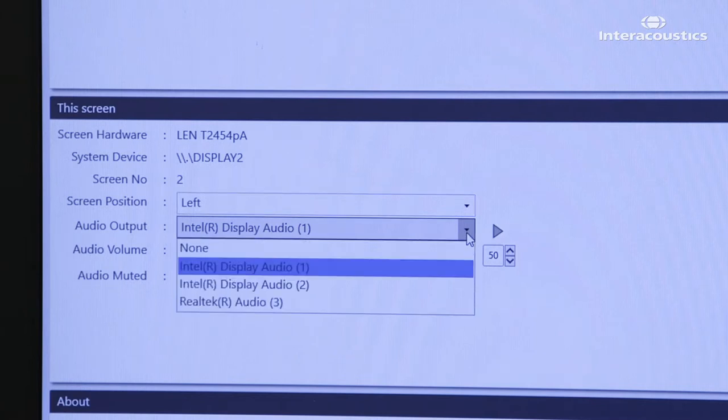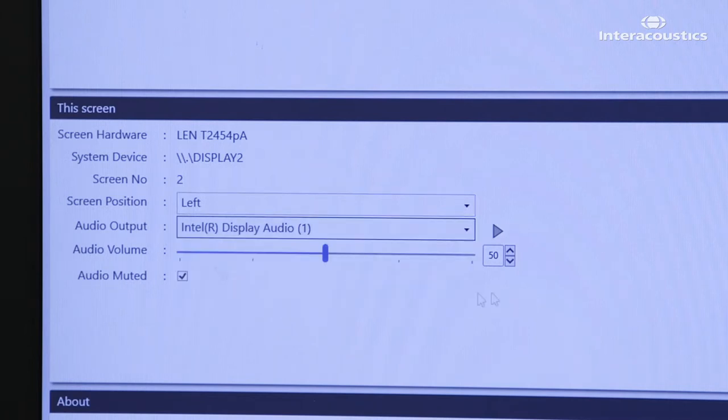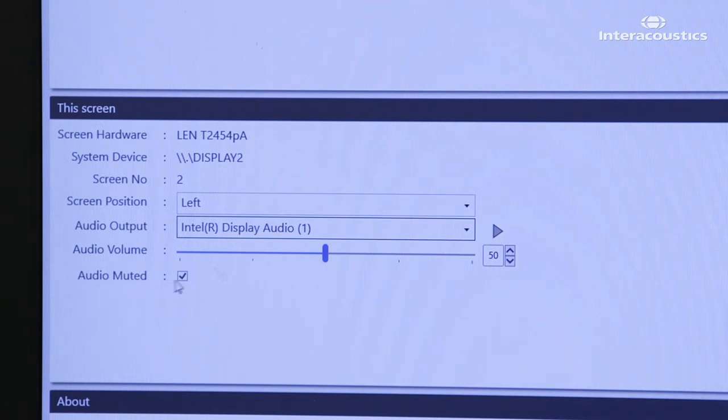You can also choose what speaker you have connected and you can choose how loud it should play the video. You can also choose if you want to have it muted if you don't want to have sound in this setup.